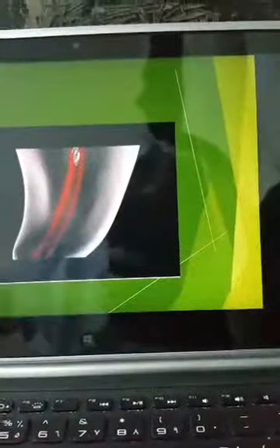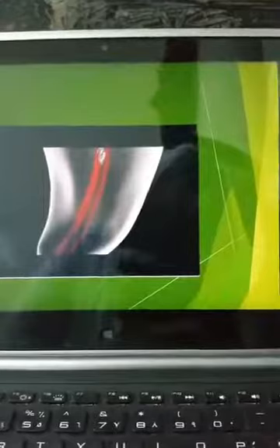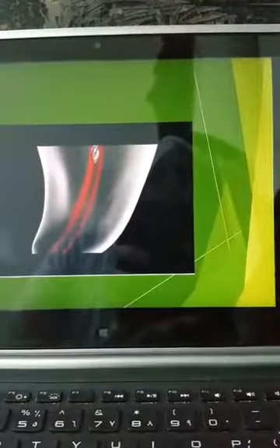So the use of Er:YAG laser in perio for the root surface is very important. Here you can apply very low power diodes, like if you want to see the margins and get a very good impression. And you could apply either the Er:YAG laser or the diode in the canal to disinfect the bacteria inside the canals.